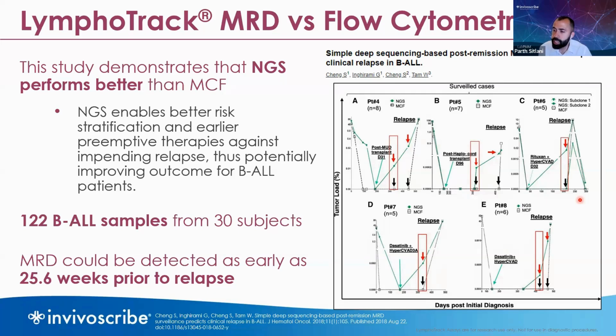And there's another question, do we need to procure the software for SHM detection? You do not. There is a LymphoTrack software that does the clonality detection and somatic hypermutation detection all in one step. Both systems are available within the same software and they happen at the same time. So as long as you are running IGHV Leader or IGH Framework 1, you will see the somatic hypermutation results in your top 10 read summary table. For each of the rearrangements, you'll see the mutation rate and the productivity of that sequence.